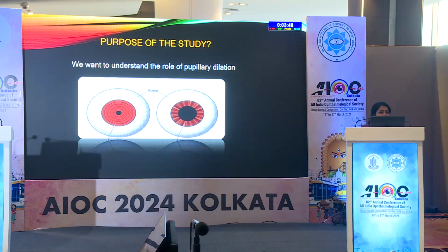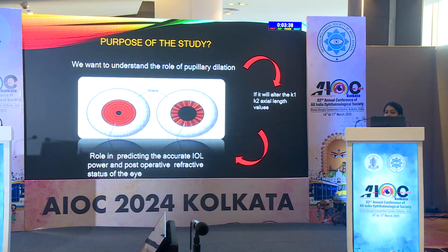The purpose of our study is to understand the role of pupillary dilatation and whether it will alter the K1, K2 and axial length when using these instruments, because it plays a role in predicting the accurate IOL power and post-operative refractive status of the eye.